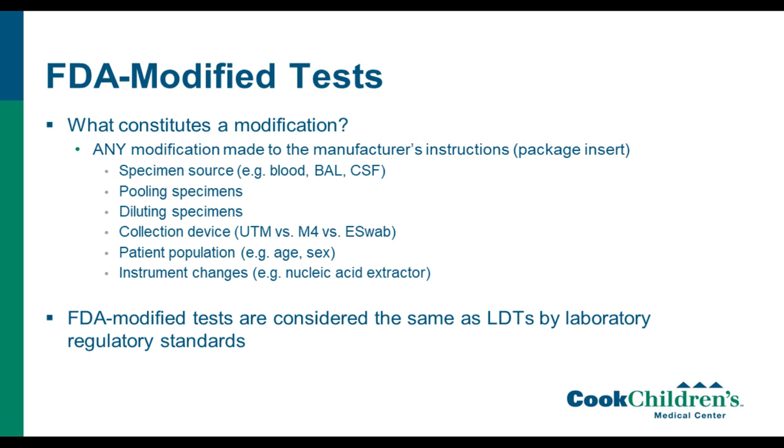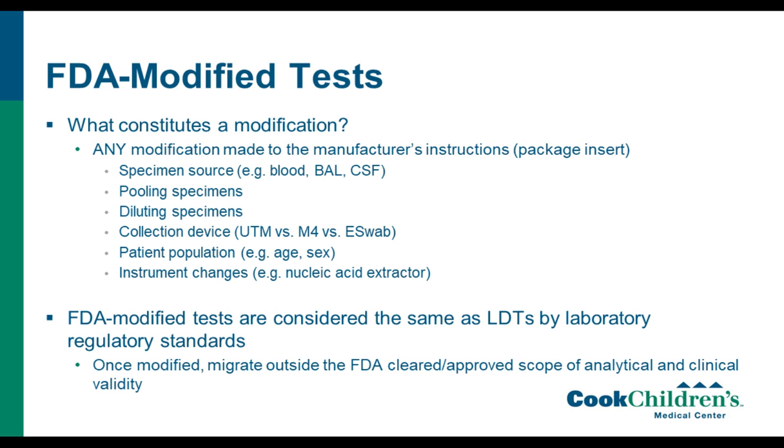And as I mentioned a little bit ago, FDA-modified tests are considered the same as LDTs when we're talking about laboratory regulatory standards. And once you modify a test, the reason why it becomes similar to an LDT is because it's now outside of the FDA-cleared scope. So when companies submit assays to the FDA for clearance, they have very defined criteria and specifications. But once you change a specimen source or pooling, now you've changed the intent and the scope of that assay. So it is more similar to a laboratory-developed test.